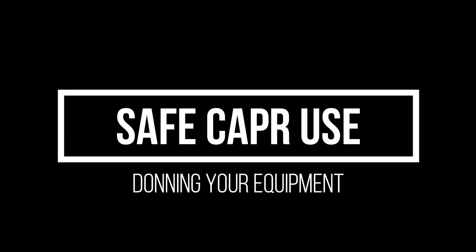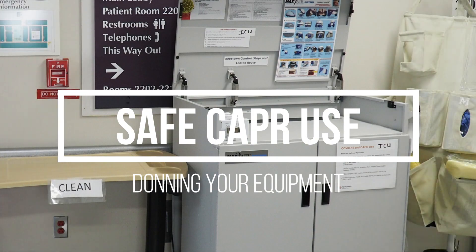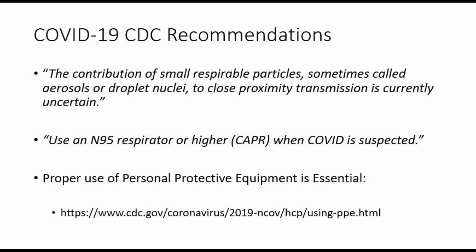In this video, we will demonstrate use of the Controlled Airway Purifying Respirator, also known as the CAPR. The CDC is uncertain at what distance a COVID patient may still be infectious. Proper use of personal protective equipment to maintain contact and respiratory barriers is essential.